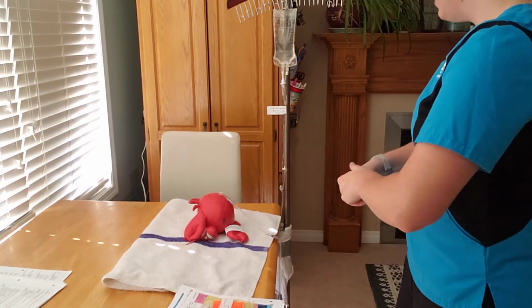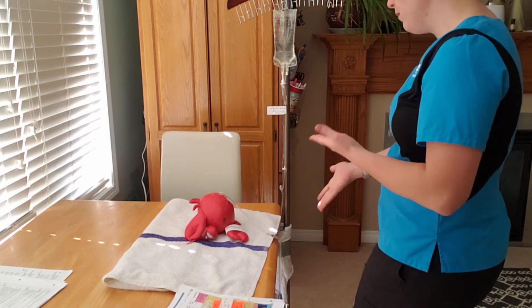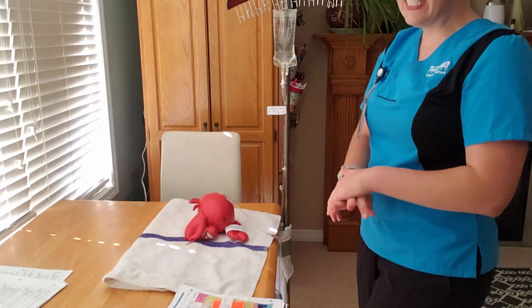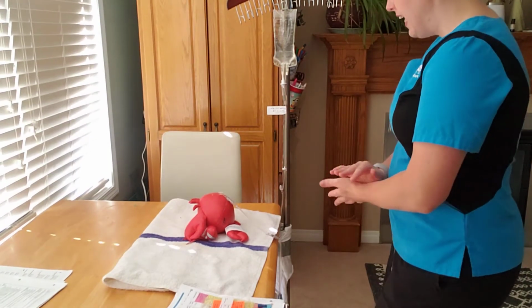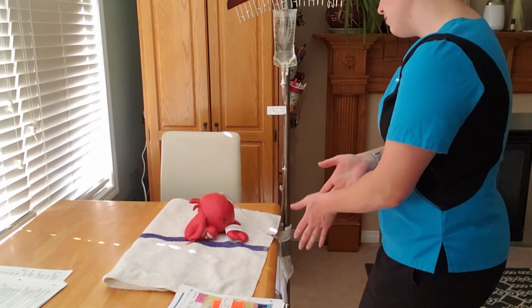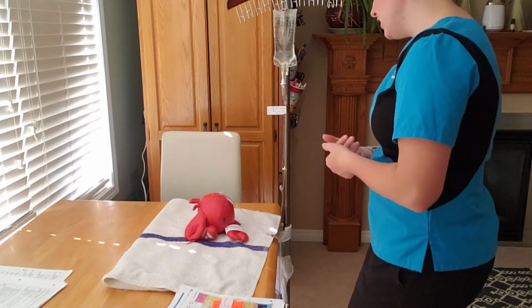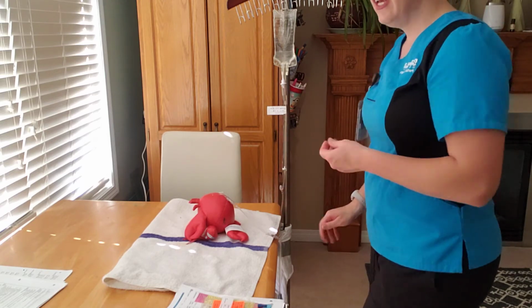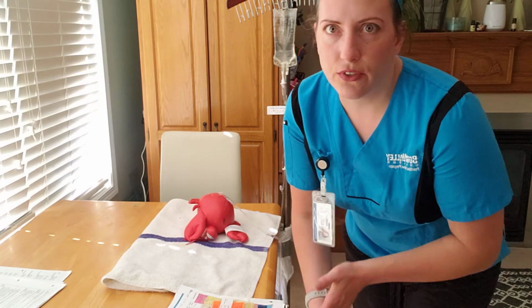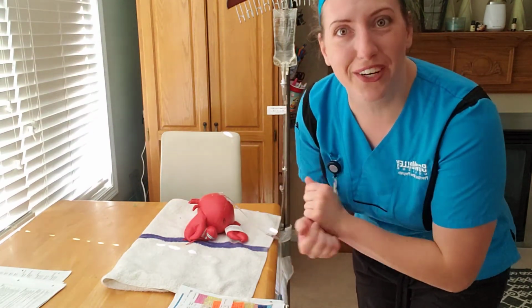Good morning, Allison. My name is Janine McIntyre. I'm a practical nurse student with Bow Valley College. How are you this morning? Allison says she's doing really good. Allison, I'm here this morning to administer a medication called ranitidine. It's for the prevention of gastric ulcers. Do I have consent to administer this medication for you? Allison states it's okay. So now that I've got my hands nice and clean, I'm gonna check her ID.